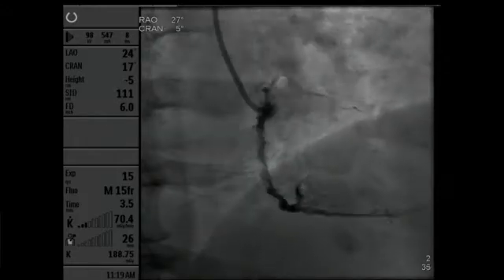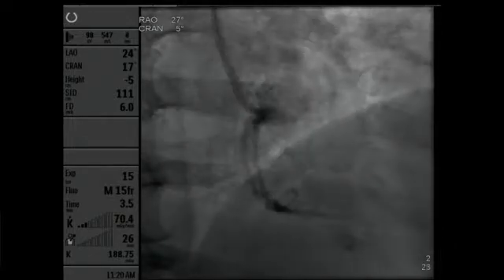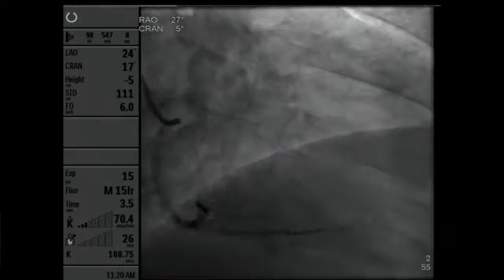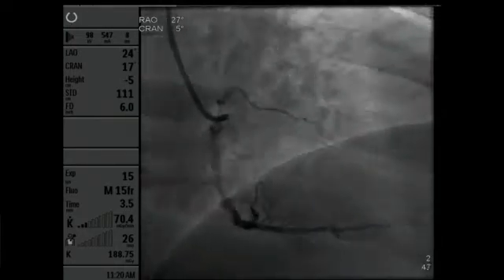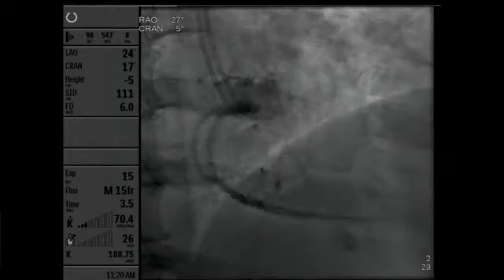Yeah, so my plan today, in almost all the cases of ISR that I'm doing in the cath lab here, is that I do prefer OCT as an imaging modality. I think it gives you better delineation of what you are dealing with in terms of the types of ISR that we defined in our paper with the Waksman ISR classification, where we talk about the types of tissue that could grow inside a stent based on the chronicity of the lesion. I do believe OCT gives you that delineation if you are dealing with intimal hyperplasia, a fibrotic neoatherosclerosis, or calcified tissue, and so on and so forth. And I believe it gives better dimensions on under-expansion and pathology behind the stent if the ISR was led by a mechanical issue. So I'm just going to go ahead and do the OCT for you.